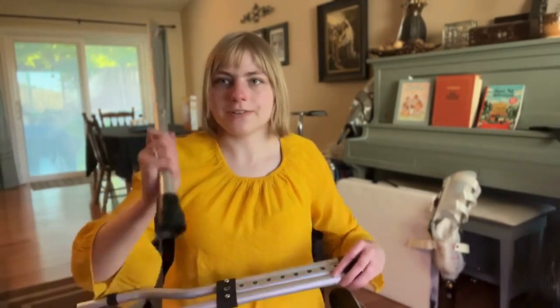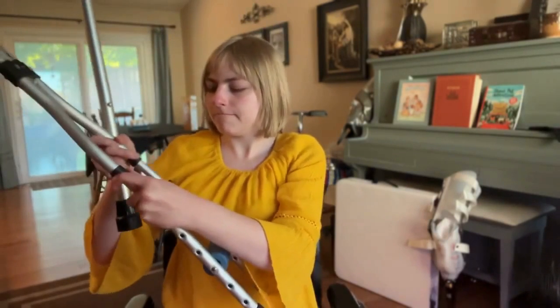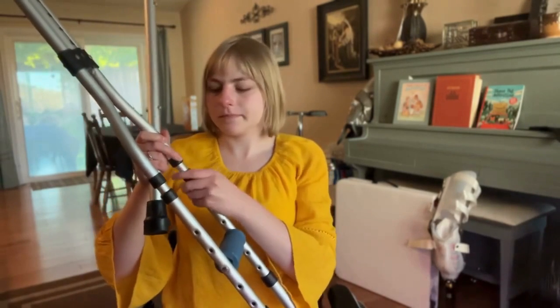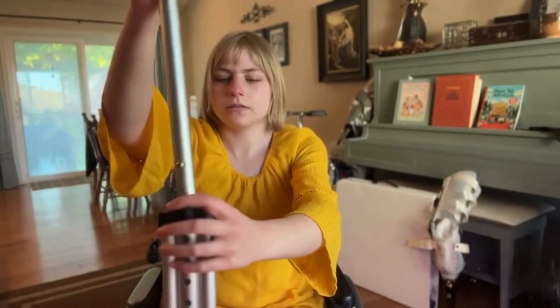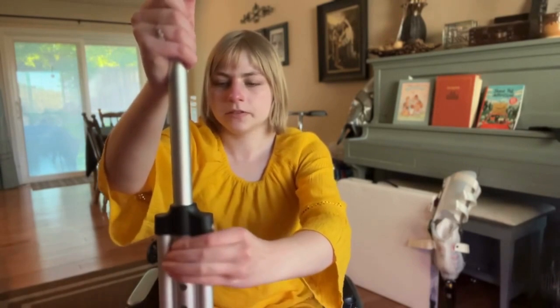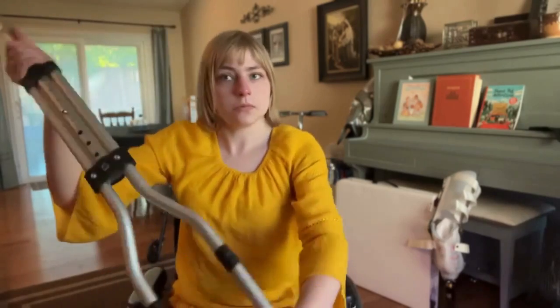There we go — bam bam bam, now unfold these babies, and then this goes in here at the top like so. You just adjust it for whatever height you are. I think right about there — we'll give that a try. I'm gonna unfold the other one and I will show you the crutches in use.